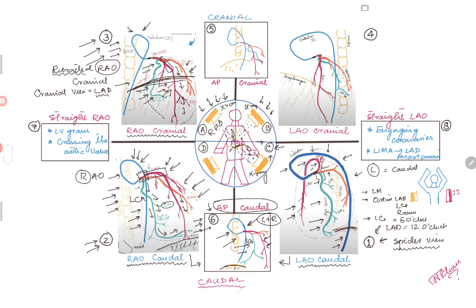Moving on to another cranial view: looking at picture four, the catheter is a JL catheter coming below the diaphragm — femoral access. The catheter is open like an L, so it's probably an LAO view, and since you see the diaphragm in the middle of the image, it's probably a cranial view. Exactly as labeled, we're talking about the LAO cranial view.